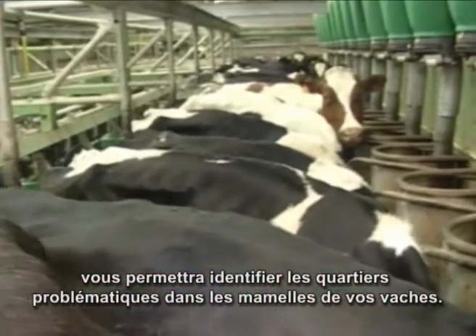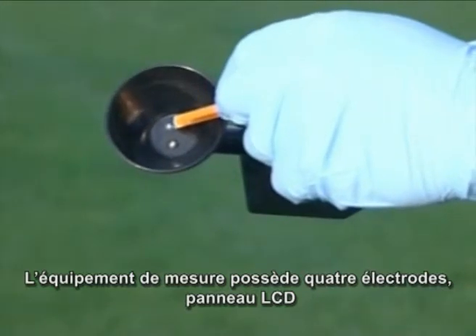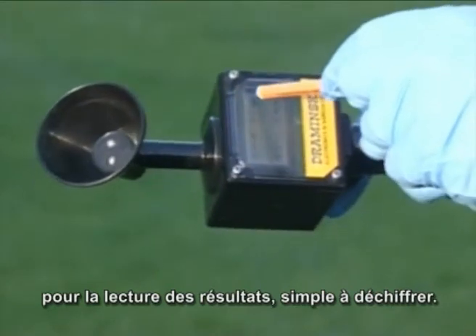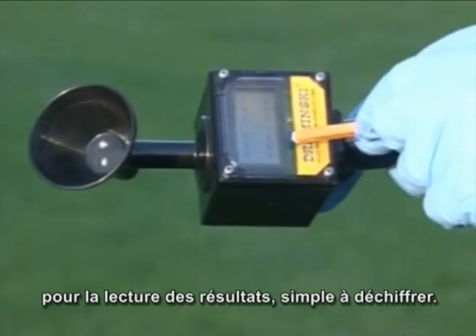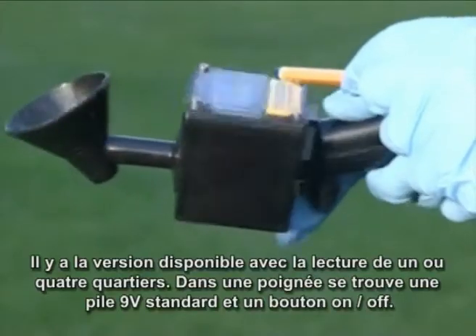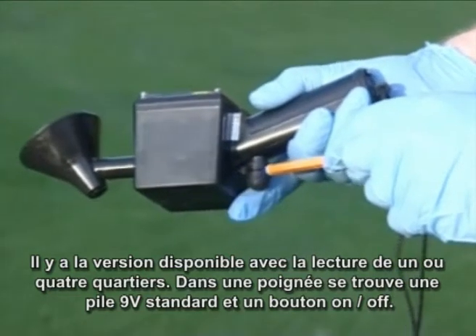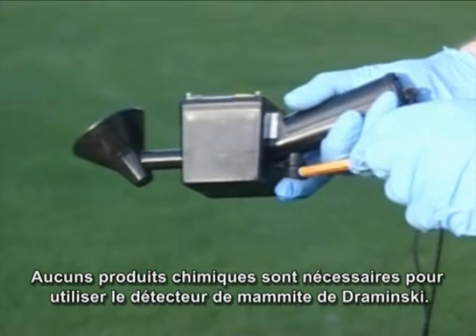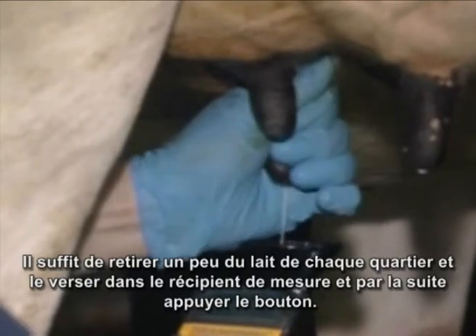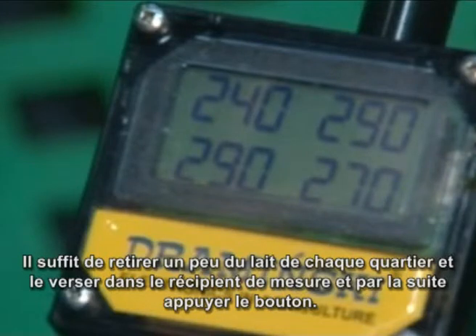The device features a measurement cup with electrodes, an LCD panel to display results with easy-to-read figures, either single or four-quarter display, and a handle containing a standard 9-volt battery and on/off button. No chemicals are required for the Draminsky mastitis detector.